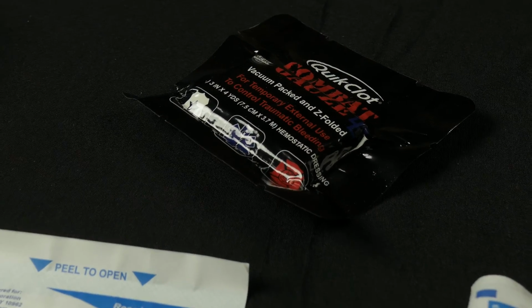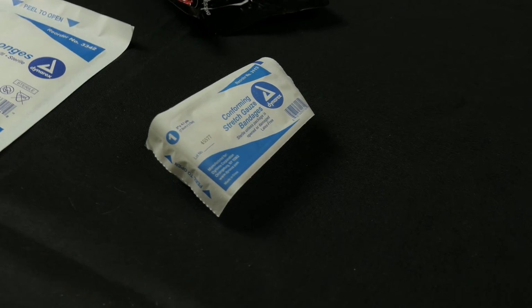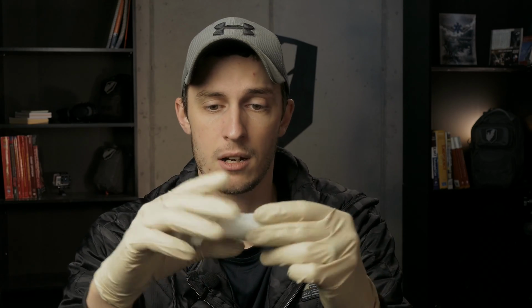So we'll go ahead and give you a rundown of the process of wound packing. So I've got my Quickclot. I've also got some regular gauze here. This regular gauze you can pull from the center and you can wound pack and it'll play out from the middle here. If you use an entire roll of gauze and you need more, just take a second one and continue on where you started from.